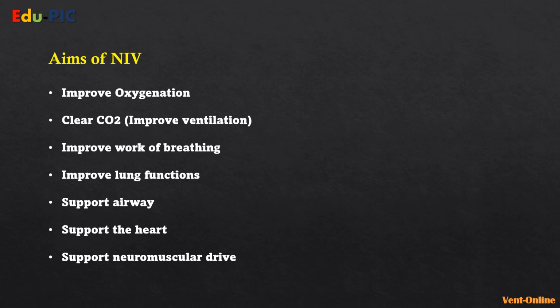If we're talking about the whole set of non-invasive ventilation, we are aiming to improve oxygenation as a main theme, because PEEP or pressure or CPAP is mainly there to improve your lung recruitment. If you add BiPAP to it, then you're trying to improve ventilation or clear CO2. You're also trying to improve the work of breathing, as we said, by improving the compliance. You're trying to improve the lung functions generally by improving the residual capacity. You're trying to support the airway, support the heart.